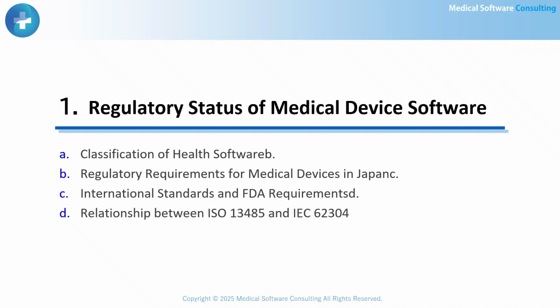We will then turn to international standards and the expectations of the US FDA, which strongly influence global regulatory practices. Finally, we will consider the relationship between ISO 13485, the quality management standard, and IEC 62304, which defines the lifecycle requirements for medical device software. Together, these standards form the foundation for demonstrating compliance and ensuring patient safety.